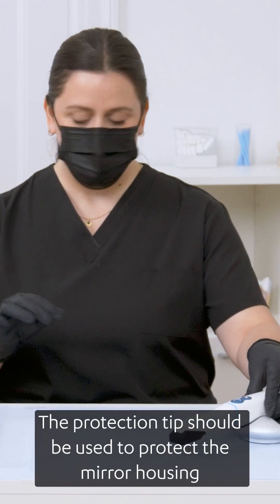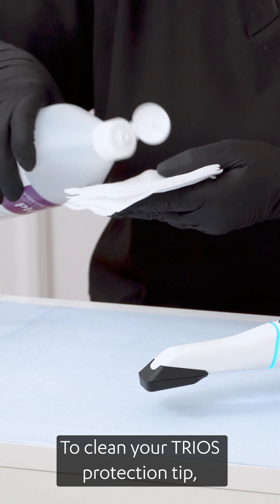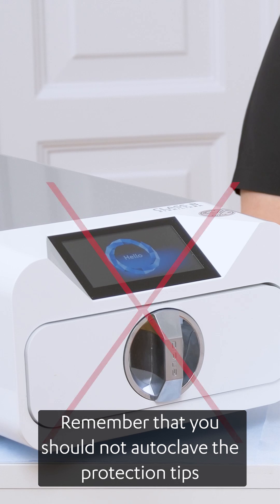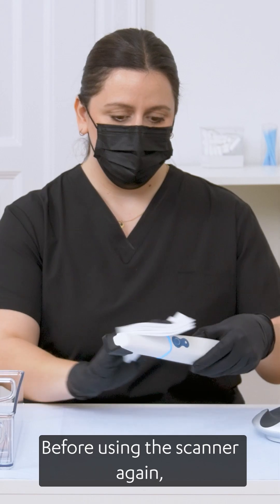The protection tip should be used to protect the mirror housing when the scanner is not being used. To clean your TRIOS protection tip, use disinfection wipes, such as cavi wipes. Remember that you should not autoclave the protection tips since they are not designed for that.